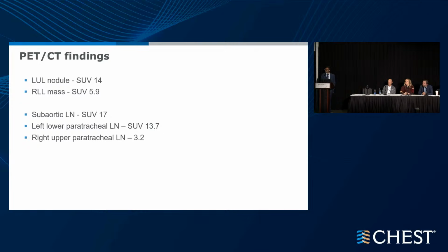Where your pathologists commonly give you a difference on malignancies and distinguish adeno from squamous, our pathologists will not do that. They will just tell us malignant. It really depends on the volume and the quality of the tissue you have. They can't really grab a diagnosis from the air, and sometimes they may be more conservative. They may say malignancy, and if they can call it, they will, but it's not a guarantee. I don't think we can always be certain of that.